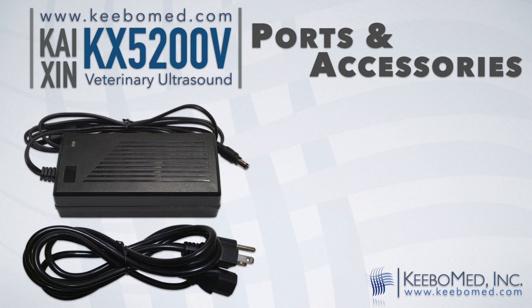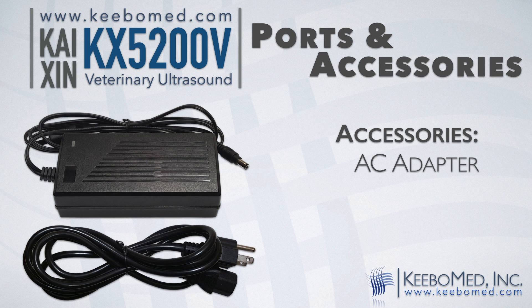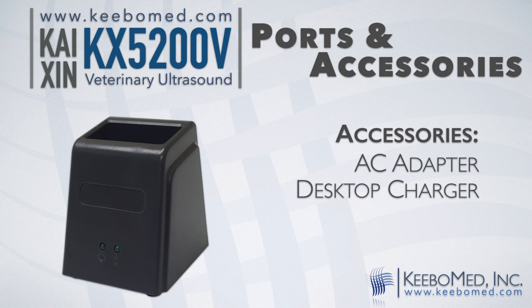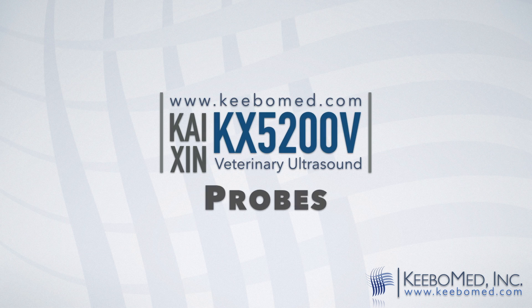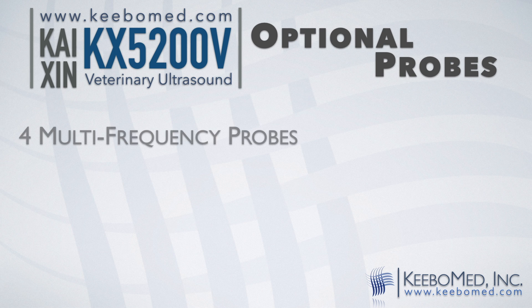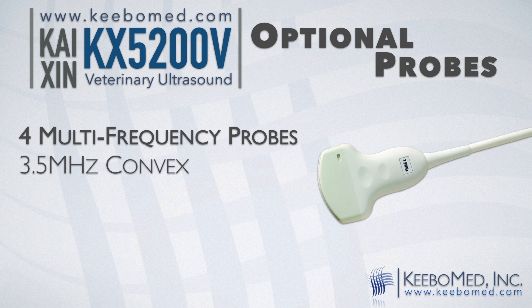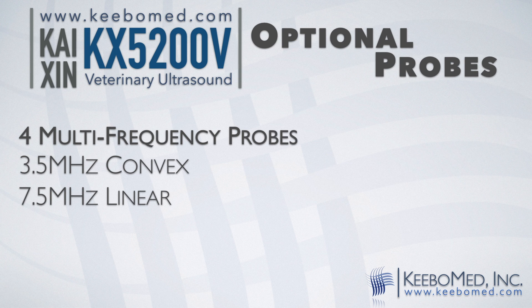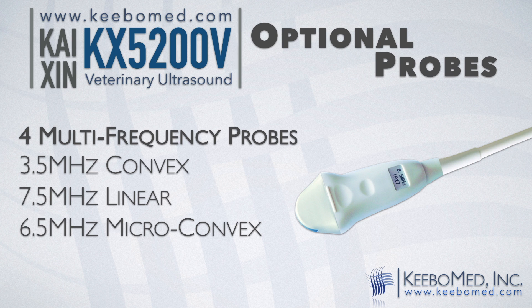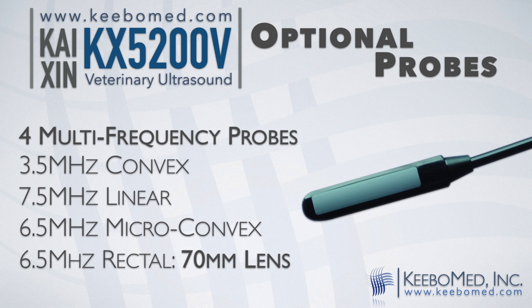Other standard accessories include an AC adapter, one desktop battery charger, and one image freeze remote. The KX5200V supports four different multi-frequency probes: a 3.5 megahertz multi-frequency convex probe, a 7.5 megahertz multi-frequency linear probe, a 6.5 megahertz multi-frequency micro-convex probe, and a 6.5 megahertz multi-frequency rectal probe with a 70 millimeter wide lens which will produce wide images.